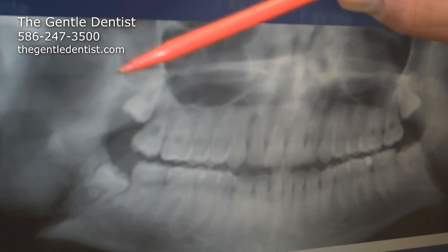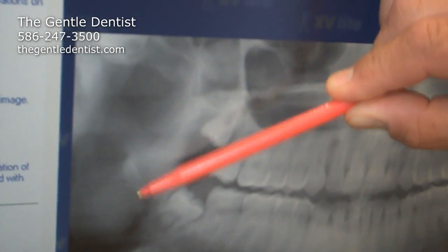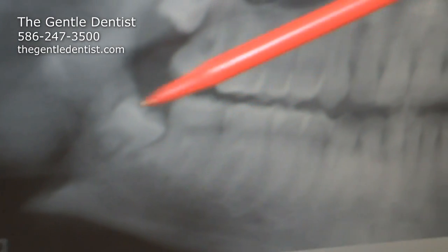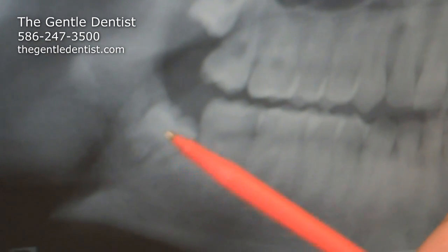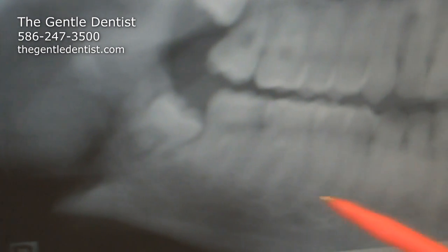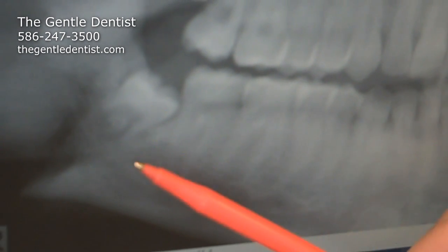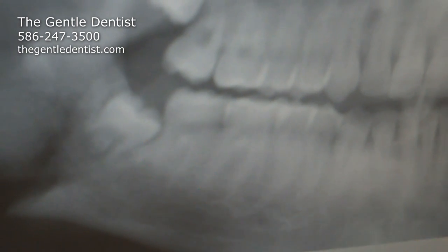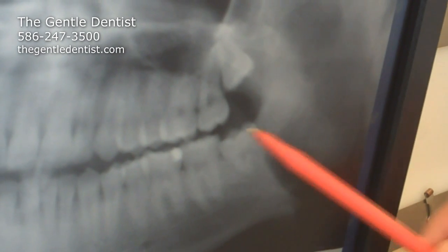The thing that we're always concerned about with wisdom teeth is that right in here is a nerve that gives sensation to the lip and the teeth, and it comes around like this. For Marshall, it's a good time to do it because the roots aren't completely formed here. Sometimes if they get really too long, like for example in this one here, it can encroach upon where the nerve is and affect the lips, causing numbness in the lips and the teeth. So this is the right side, this is the left side. Once again, this is where the nerve traverses down here, and we're going to remove this.